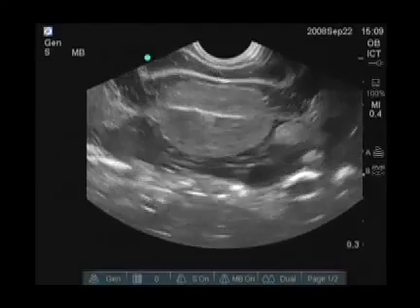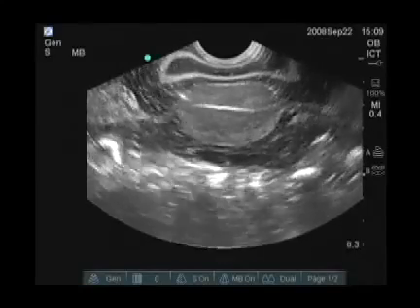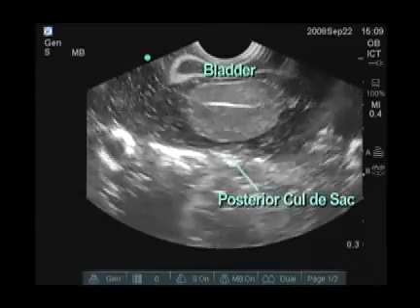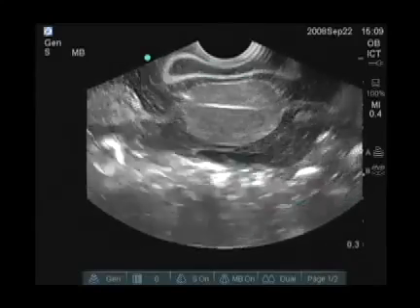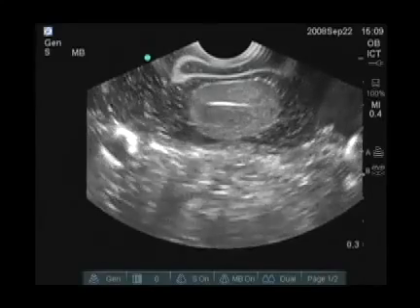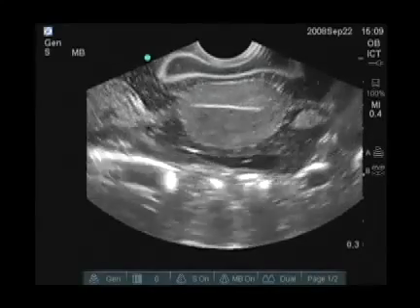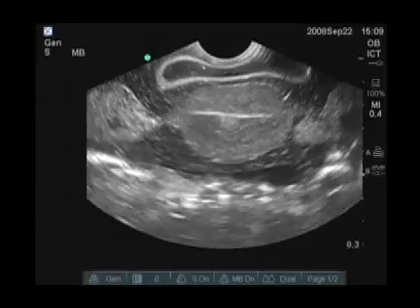Moving back towards the midline, the anechoic area just posterior to the uterus represents free fluid or blood. Those are the views needed to do a thorough assessment of the pelvis for early pregnancy.